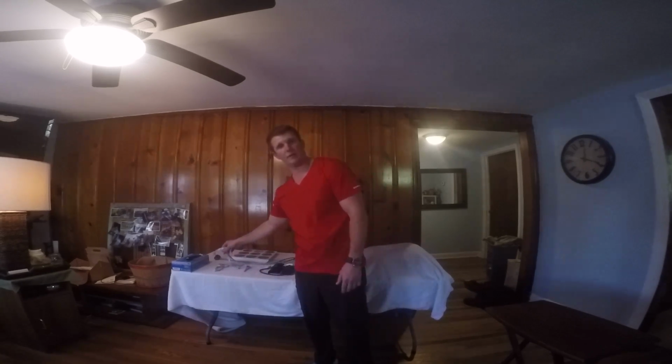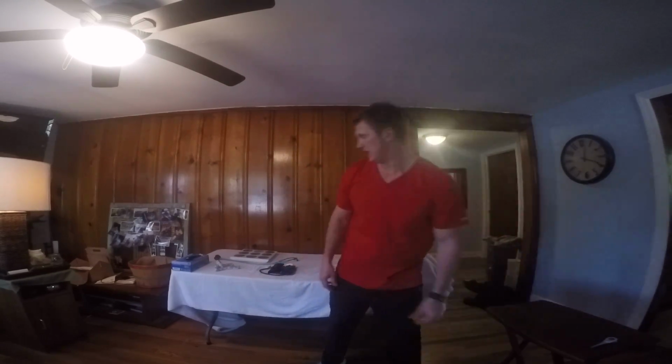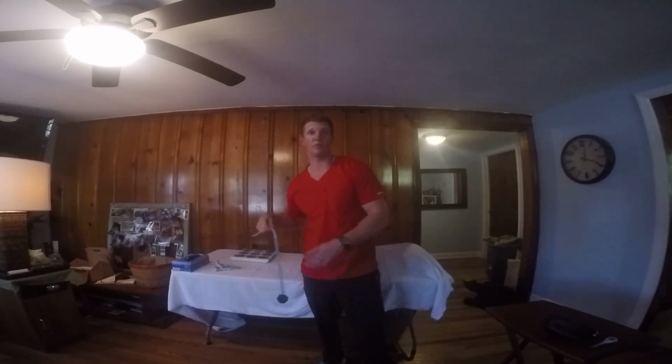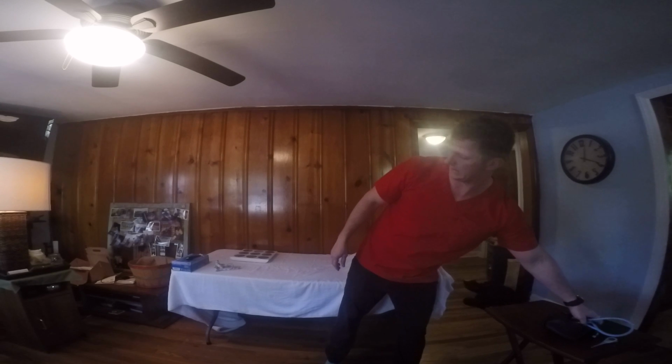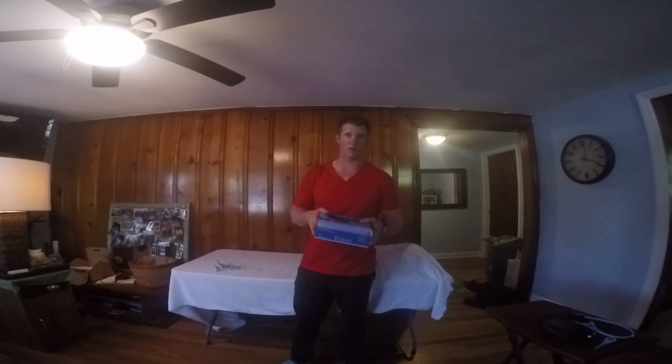So we have a tape for measuring height. I also have a thermometer for measuring temperature. I have a sphygmomanometer for measuring blood pressure. I have a stethoscope for measuring blood pressure, a scale for the weight of the patient, and gloves for PPE.